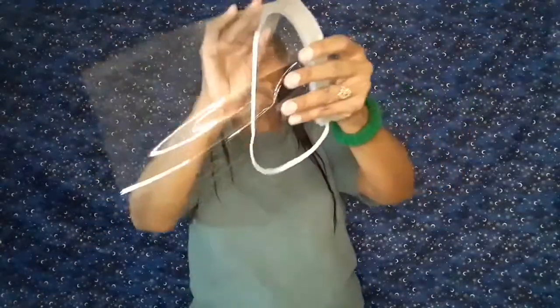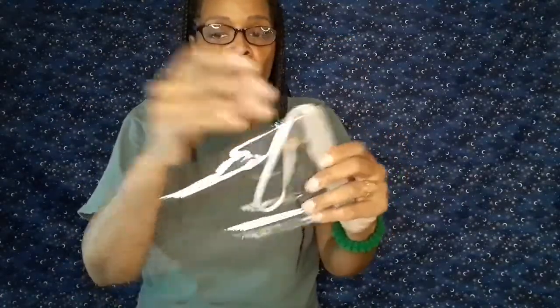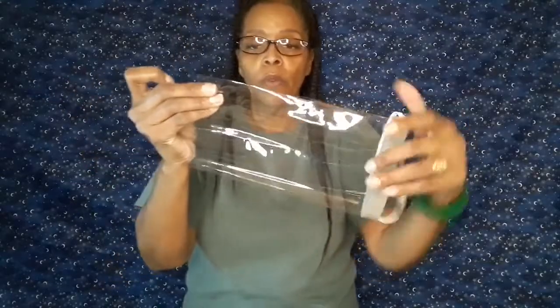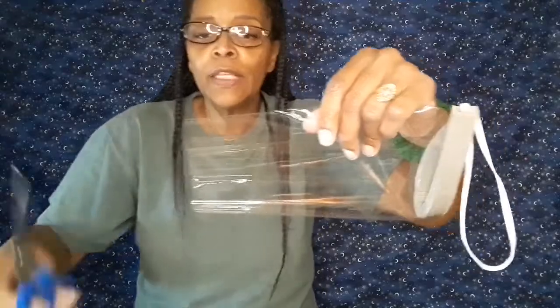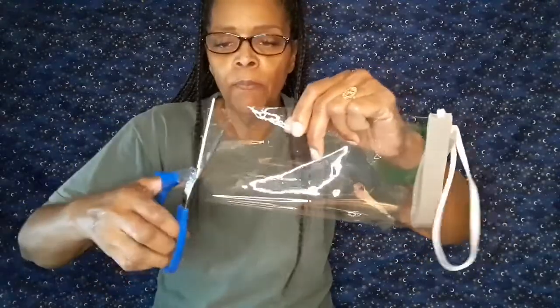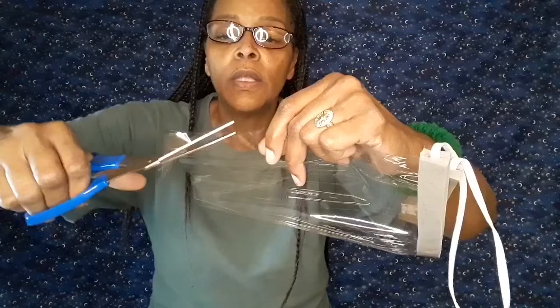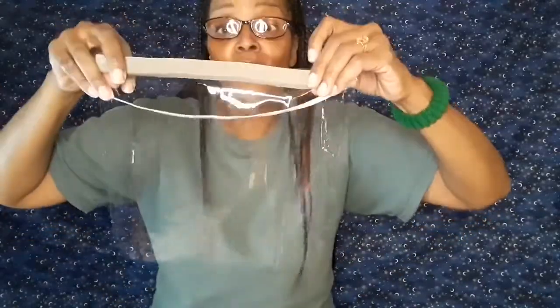Now that you've done that, it's almost cool. Fold it in half, and your two ends together here, those square ends, you want to round off. Some people will put a round circle or something circular down to make that cut. But again, if you're making masks with kids and they've got their little scissors, you just want to start at one corner here, close to the corner. You want to make just a little circle. You just want to round it off. And your mask is just about done.